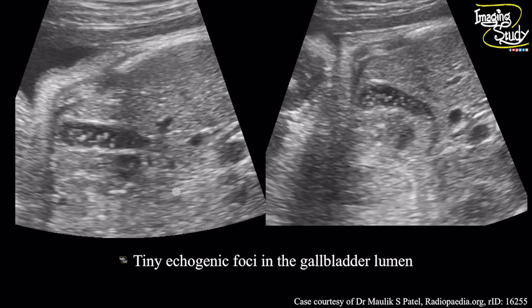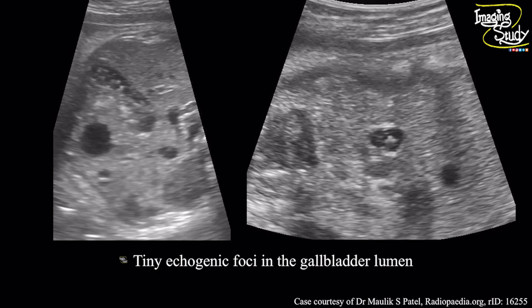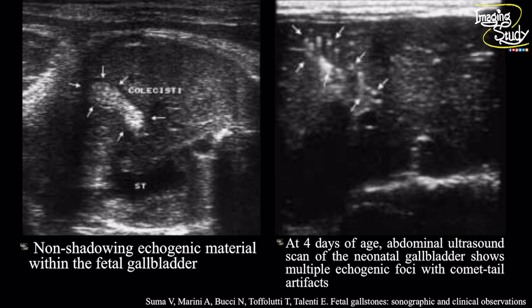Another case: you can see the gallbladder lumen here with multiple hyper-echogenic foci within the gallbladder lumen. Again, the gallbladder in longitudinal and transverse section with hyper-echogenic materials noted, indicating gallstone. In the next case, the gallbladder lumen is filled with hyper-echogenic material and no posterior acoustic shadow is noted. The right image is of the same baby but it is the postnatal scan done at four days of age, and we can see on trans-abdominal ultrasound multiple hyper-echogenic structures within the gallbladder lumen casting some comet-tail artifacts.